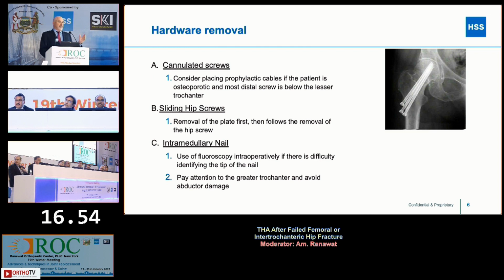So I agree. I do agree that sometimes if you're going to cement, those holes can also cause a problem with extrusion. Sometimes just putting your fingers in there can help you do that. But I want to talk more about the sclerotic bone. It's not very deep. It's right in the neck, and oftentimes you just take a high-speed burr and it's all gone. But if you take the screws out and just start to broach, I promise you're going to break it. And one more point I would like to add, along with that, entry point has to be perfectly lateral. Because if your stem entry is in varus, then there is a chance of shattering the bone on that side. Exactly.